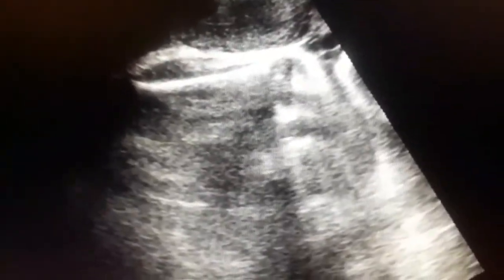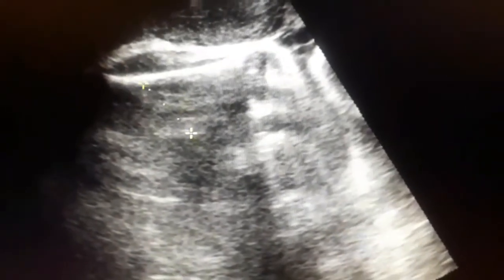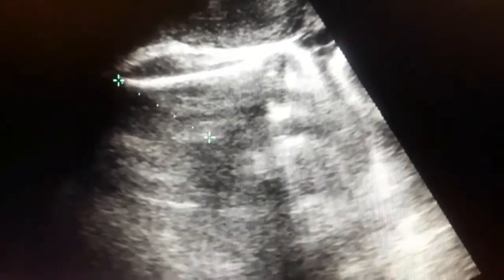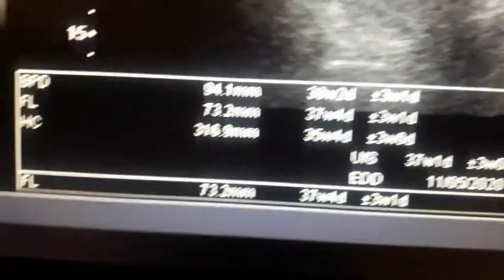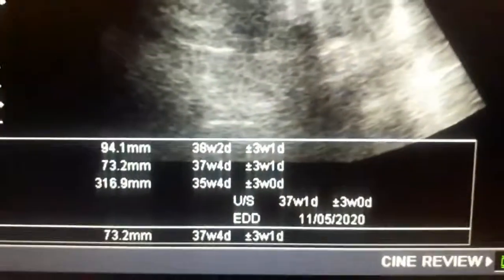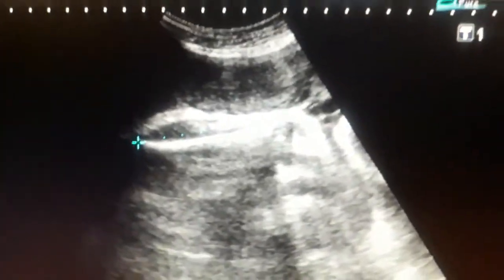Now I am trying to fix the femur to calculate the femur length. I would also like to look at the genitals in the same setting. This is the femur length — it is about 37 to 38 weeks. Now look at the genitals between the two femurs.